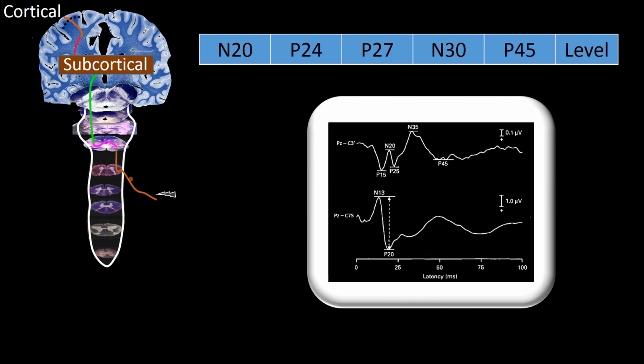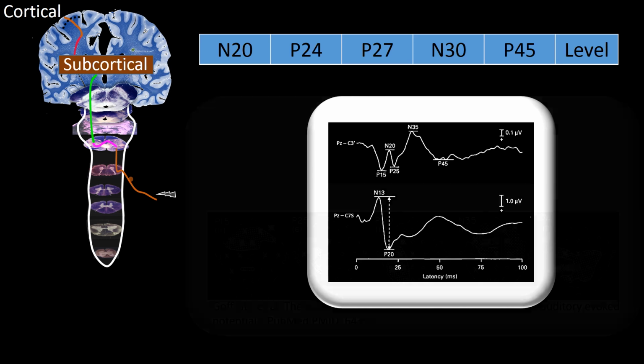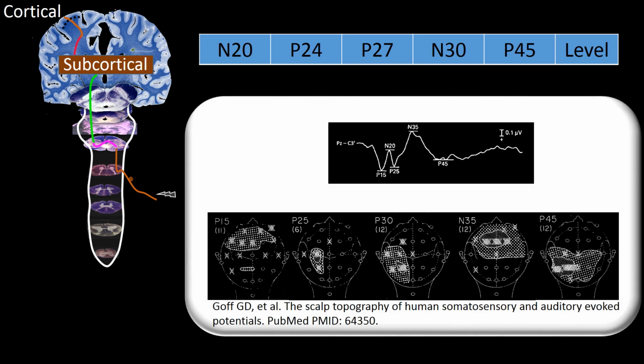I have added this somatosensory evoked potential to give you an idea of time and delayed potentials, since we have not ever mentioned P45 before in any of our talks. Now I have added the isopotential fields of some of the potentials that we are mentioning while answering this question.